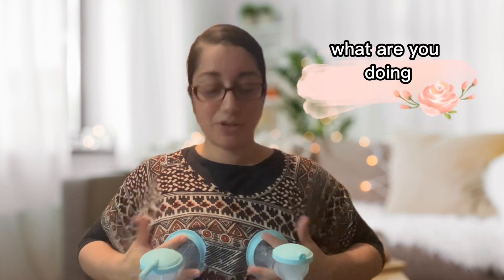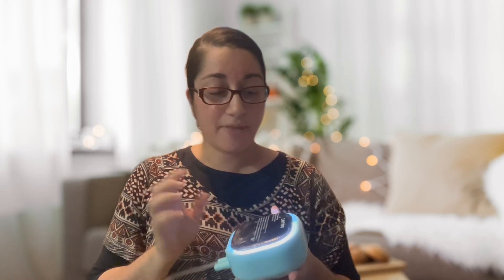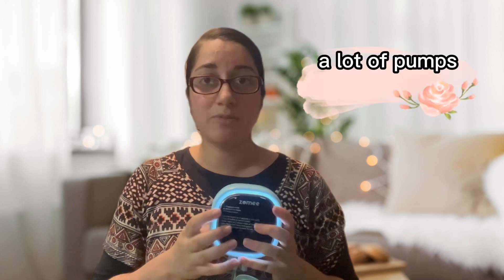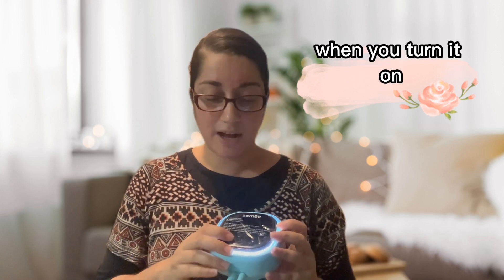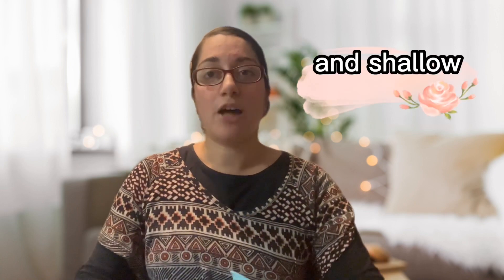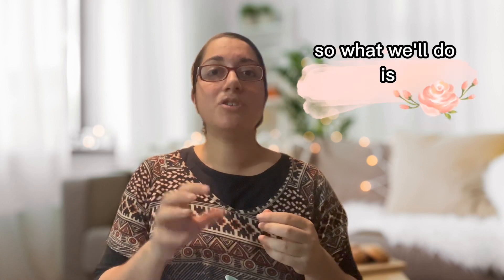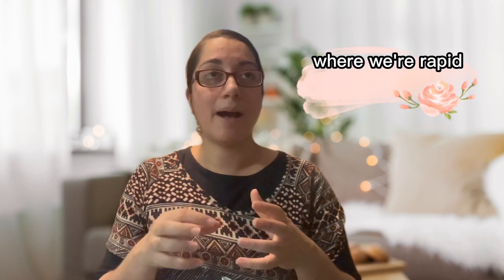For the modes — today I have a Zomee pump, and there are so many different pumps out there. This one is good because it has different modes: a massage mode and an expression mode. When you first turn it on, you'll start with the massage mode, which is very rapid and shallow — just like babies when they first latch on. We put it onto that massage mode first, rapid and shallow.